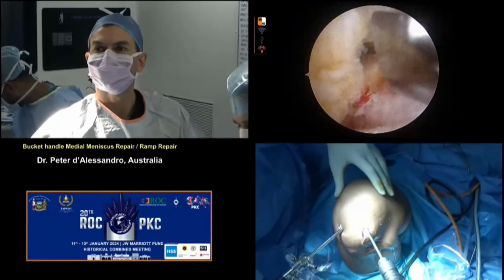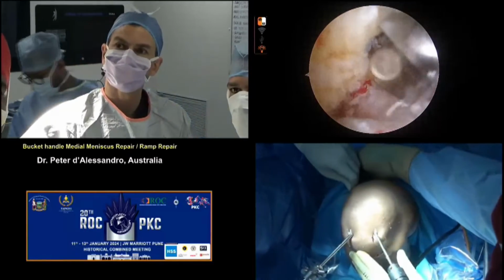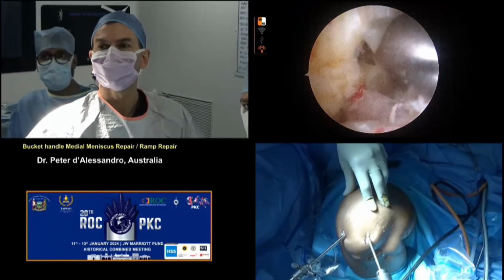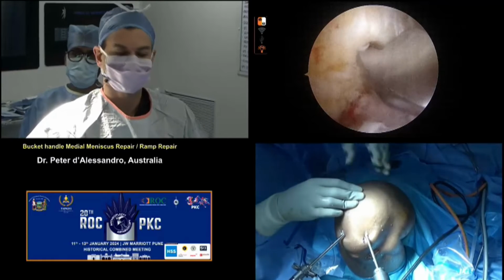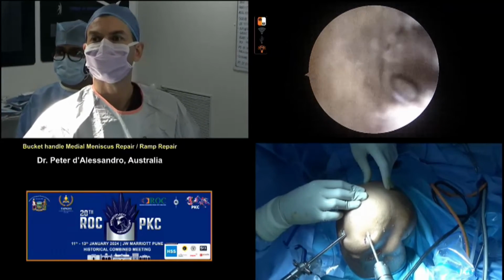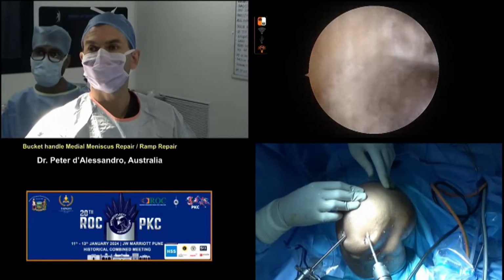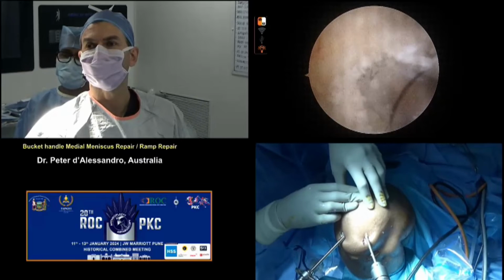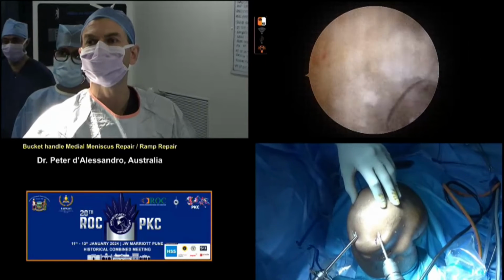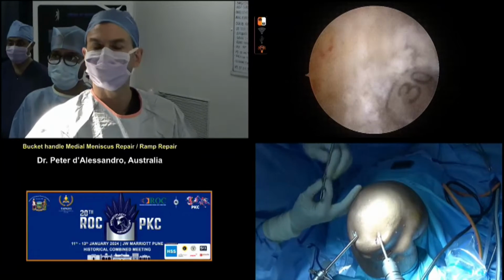So Peter, in terms of your graft, you mentioned that you have an 8-9 graft, right? So you put 8 in the femur, 9 in the tibia. What's your thought process behind that in terms of size? And then also the second question is going to be looking at the length of your graft. What is the length of your graft overall? And do you always do a 25 millimeter tunnel on the femoral side? Yeah, also a great question. I always try to replicate normal ACL anatomy that fans out on the tibial side. The length issue is really important.